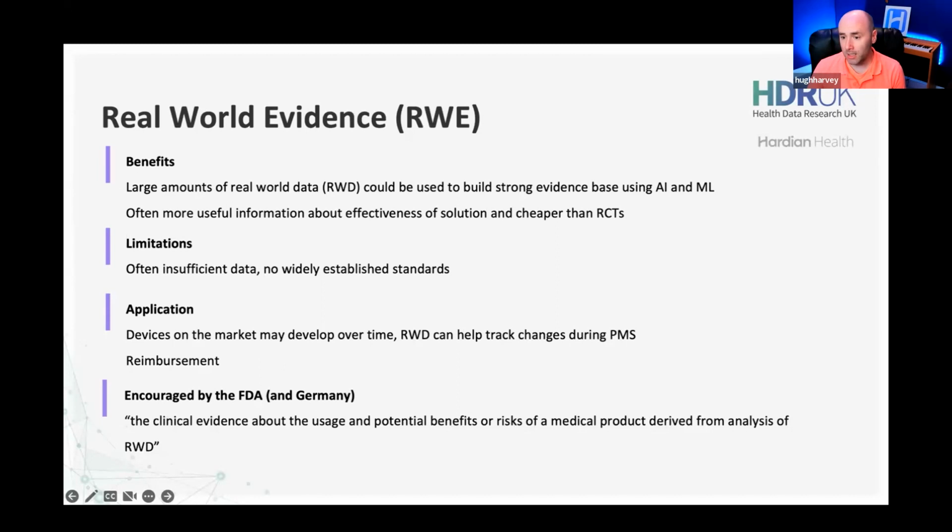Second question, Helena has asked, what's the suitable lifetime for a software as a medical device, including AI, and how is it best to determine it? Really good question. And I think it's almost too early to know, really, and it will depend on several factors. Obviously, the IT environment in which you deploy. The lifetime of your device is really only going to be suitable for the lifetime of that IT environment. And as long as performance does not drift too far away from the baseline performance that you are claiming as demonstrated by your pivotal investigation.